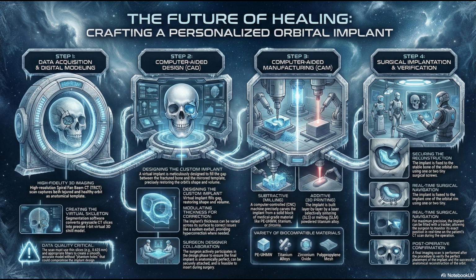And that's to avoid the stepping artifacts, right? Exactly. If you have big gaps between the slices, you get this jagged, stepped surface on your digital model. And an anatomical model with those kinds of artifacts is guaranteed to be inaccurate.